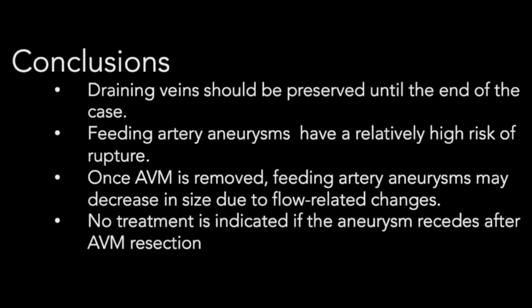This case reveals many important points. Draining veins should be preserved until the end of the case. Feeding artery aneurysms have a relatively high risk of rupture, estimated at 1% per year. Once the AVM is removed, however, these feeding artery aneurysms may decrease in size due to flow-related changes. No treatment is indicated if the aneurysm recedes after AVM resection. Post-operative follow-up angiograms are indicated for this reason.